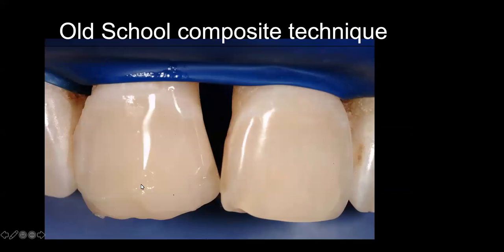So, you know, it's funny. I put the composite in the tooth, and I'm going to be doing some smoothing in a minute. And I don't have that slide, but I still remember doing this case, and I handed the patient some floss. As I finished this, took the rubber dam off and gave him some floss, I said, I want you to feel the margin here. Your margin is so amazing, because I love margins. I still do. And the guy was so upset.